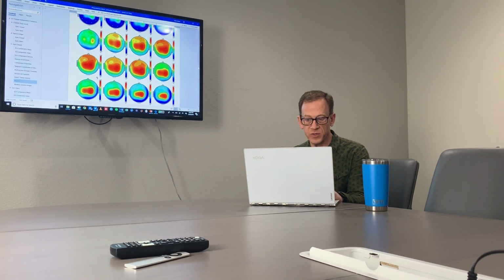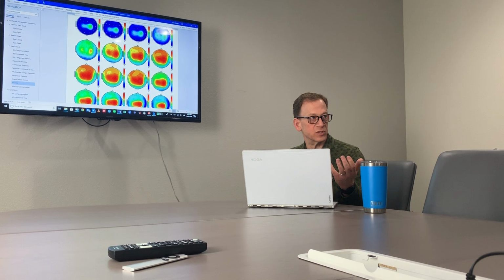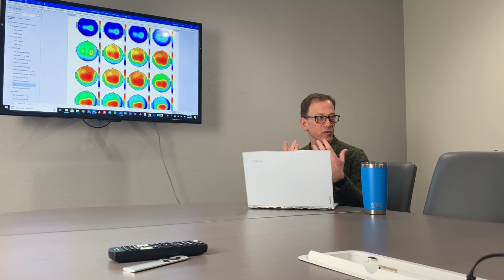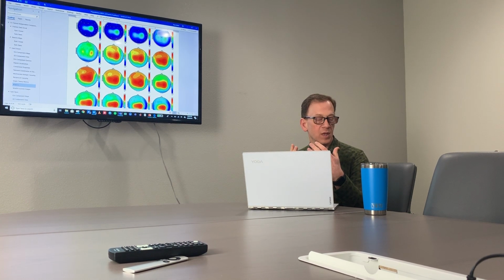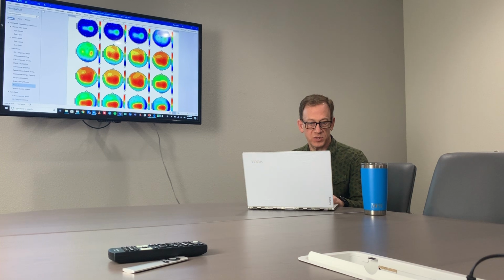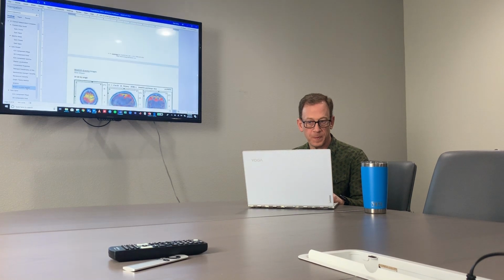And now we know the frequency the problems are in terms of power, so we can use those as our inhibits, our amplitude inhibits, in our neurofeedback training. And we use the connectivity metrics for our reward band when we do our coherence training. So we're always trying to enhance coherence where it's low, and we're trying to inhibit amplitude where there's too much of it, which is how the therapy works.